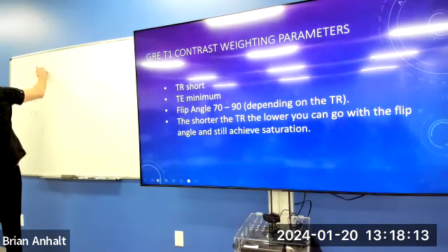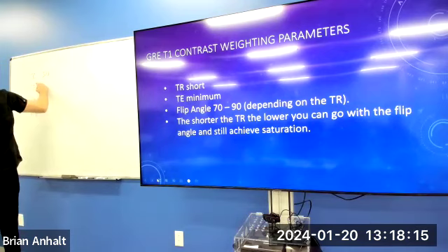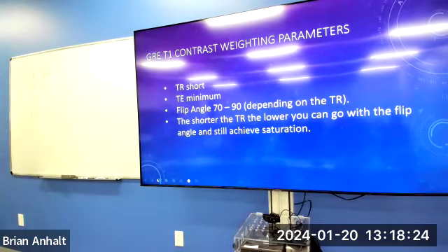Say my TR is 300. TR, long or short? Short, right? TE, 3, long or short? Flip angle, 75, high flip angle or low flip angle?